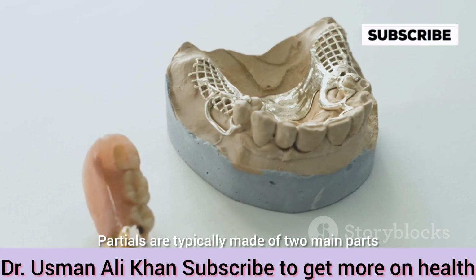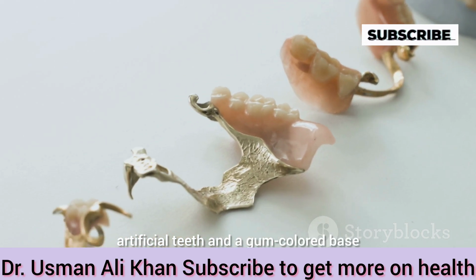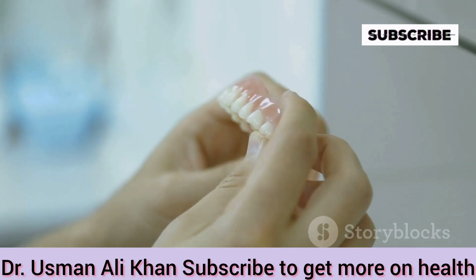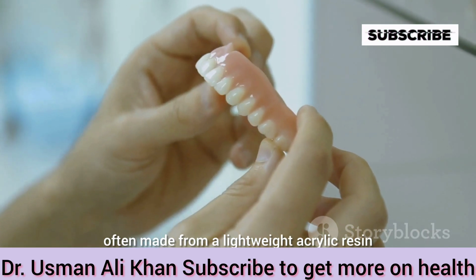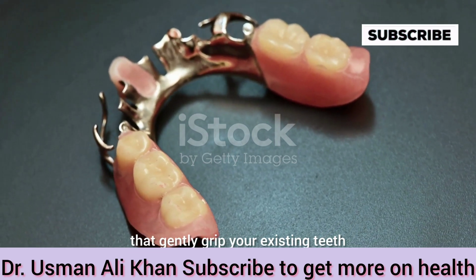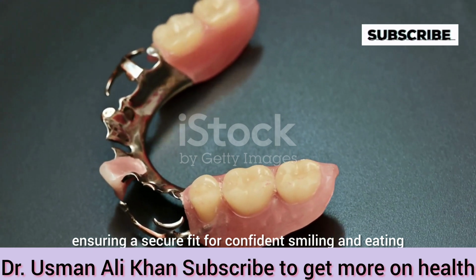Partials are typically made of two main parts, artificial teeth and a gum-colored base. The base is designed to be comfortable and discreet, often made from a lightweight acrylic resin. They are held in place by clasps that gently grip your existing teeth, ensuring a secure fit for confident smiling and eating.